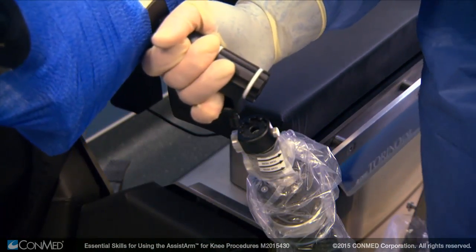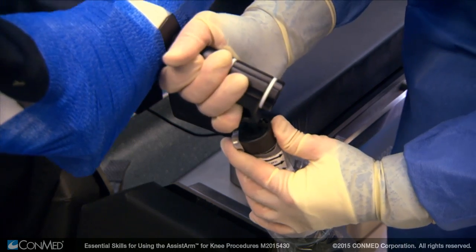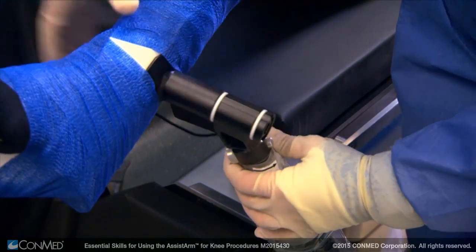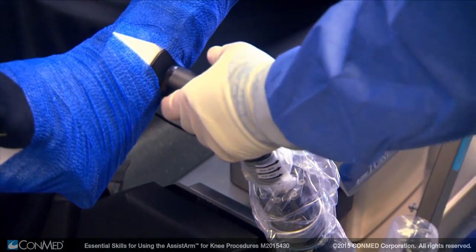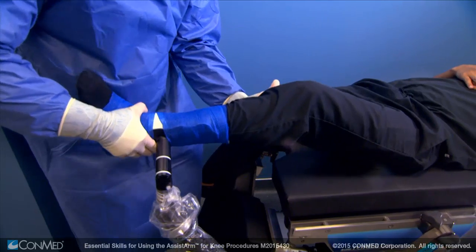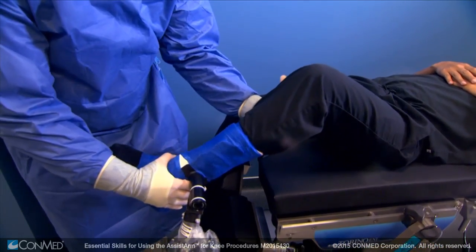Insert the knee support into the connector by pressing the connector button in and dropping the knee support into place. Give the knee attachment a slight tug to make sure it has connected properly. The patient's leg is now ready to be maneuvered where needed by the surgeon.